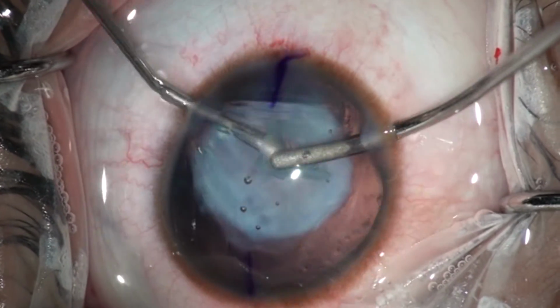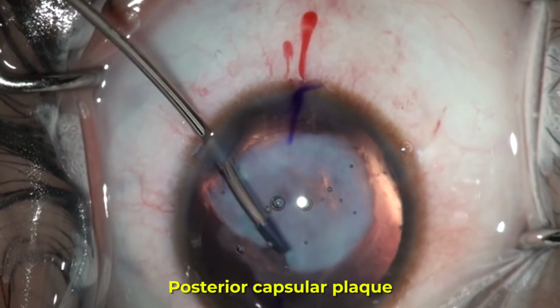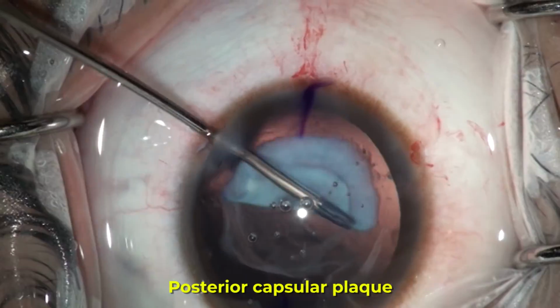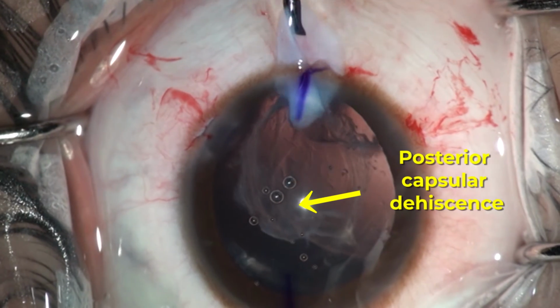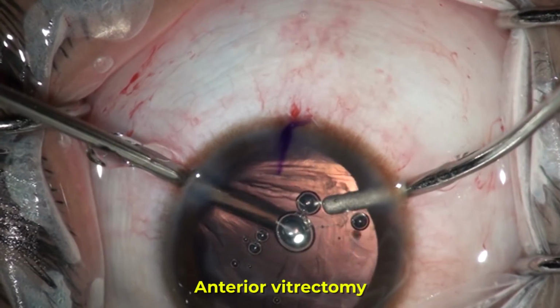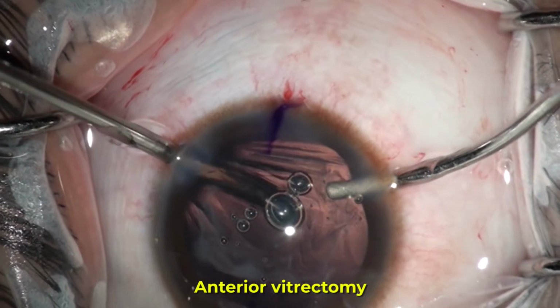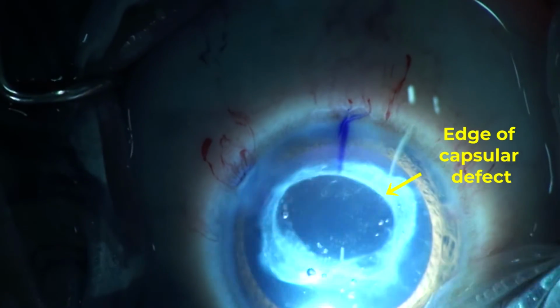Then, a good 360 degree hydrodissection is done for the remnants in the equatorial plane. The existent posterior capsular plaque was carefully removed. Seen here now is the capsular dehiscence. And an anterior vitrectomy was done in the area of the pre-existing posterior capsular dehiscence, and the endoilluminator was used to notice the fibrotic edges of the defect.